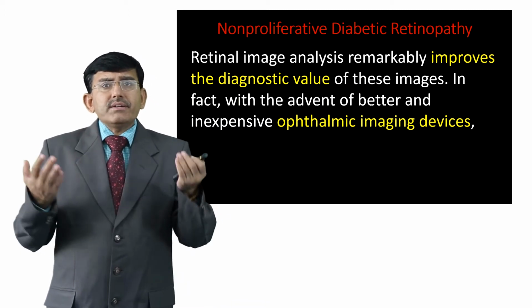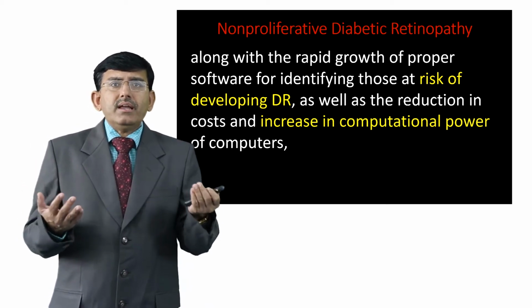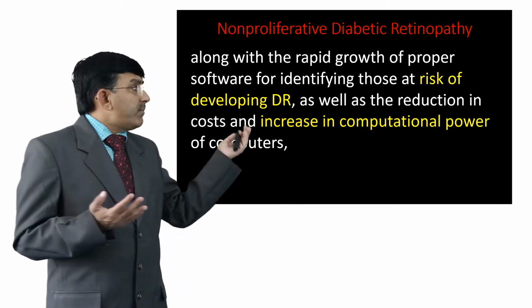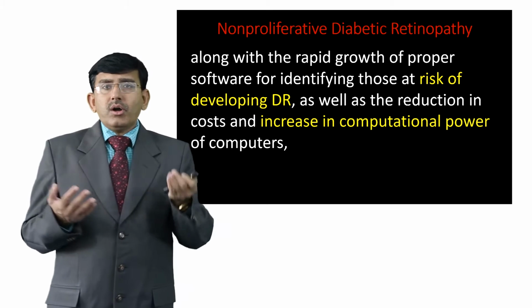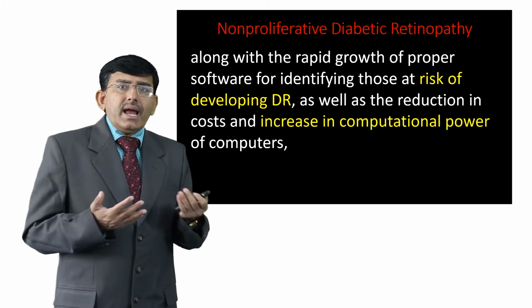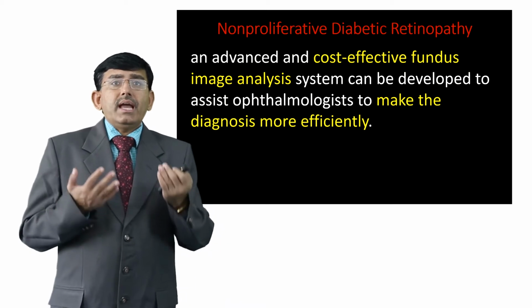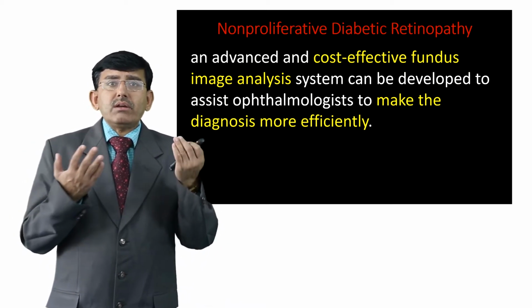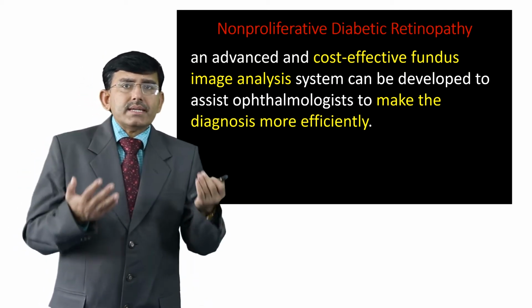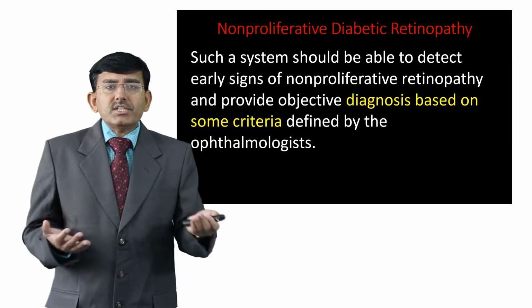ophthalmic imaging devices, along with the rapid growth of proper software for identifying those at risk of developing diabetic retinopathy among diabetic patients, as well as the reduction in cost and increase in computational power of computers, an advanced and cost-effective fundus image analysis system can be developed to assist ophthalmologists to make the diagnosis more efficiently.